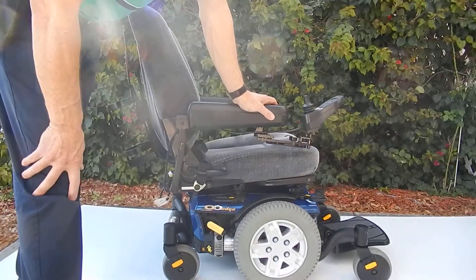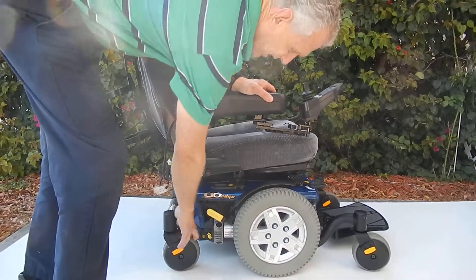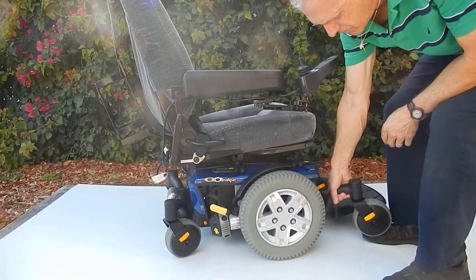This is a Quantum 6 Edge basic. This chair has solid tires all the way around and great suspension. The suspension on the right side of this chair is fantastic. You can see the suspension on the motor and the wheel.